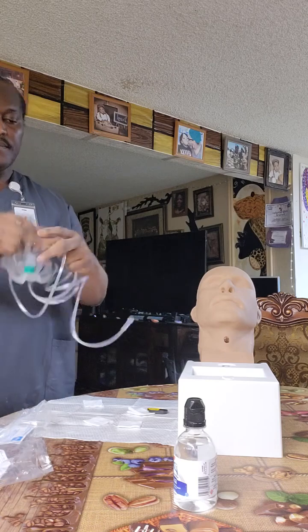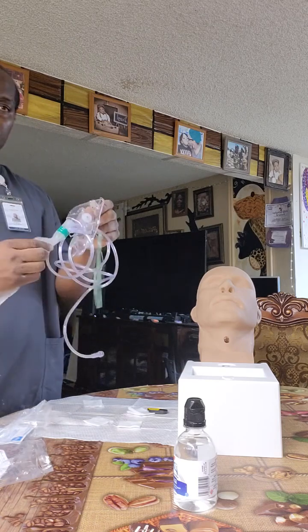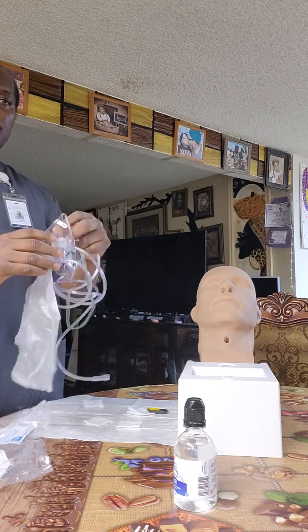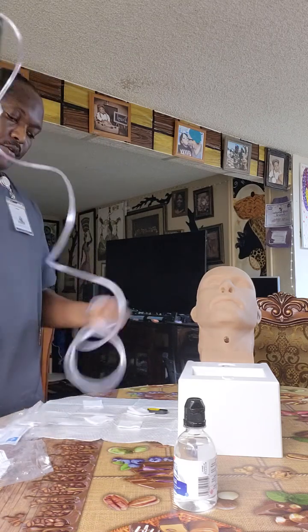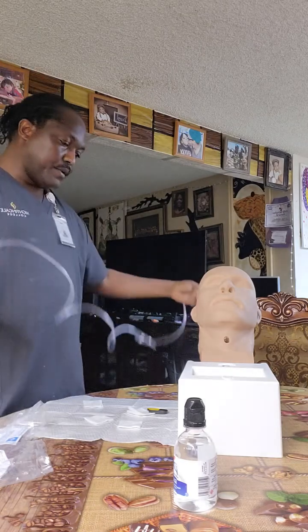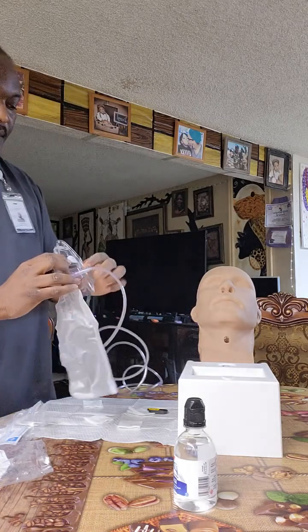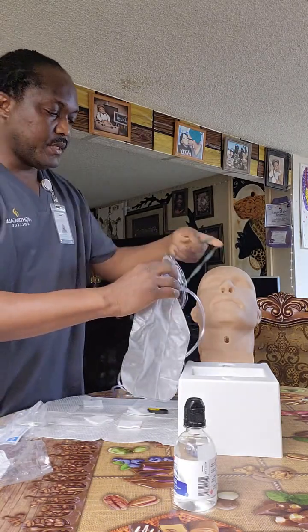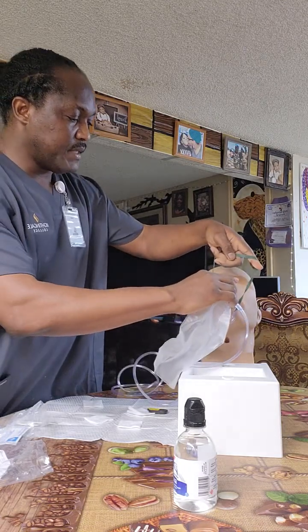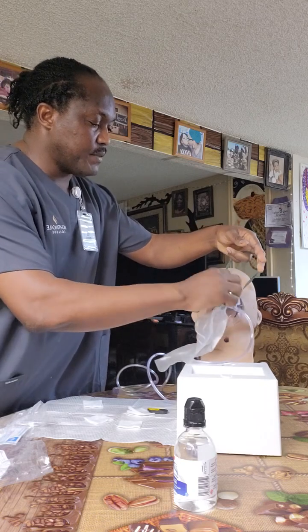So with this, it has a bag. And it's going to cover both the mouth and the nose of the patient. So I'm still going to connect this to the oxygen flow meter. Then I'll strap it on the occipital area of the patient by placing this on the nose and ensuring that it covers the mouth.